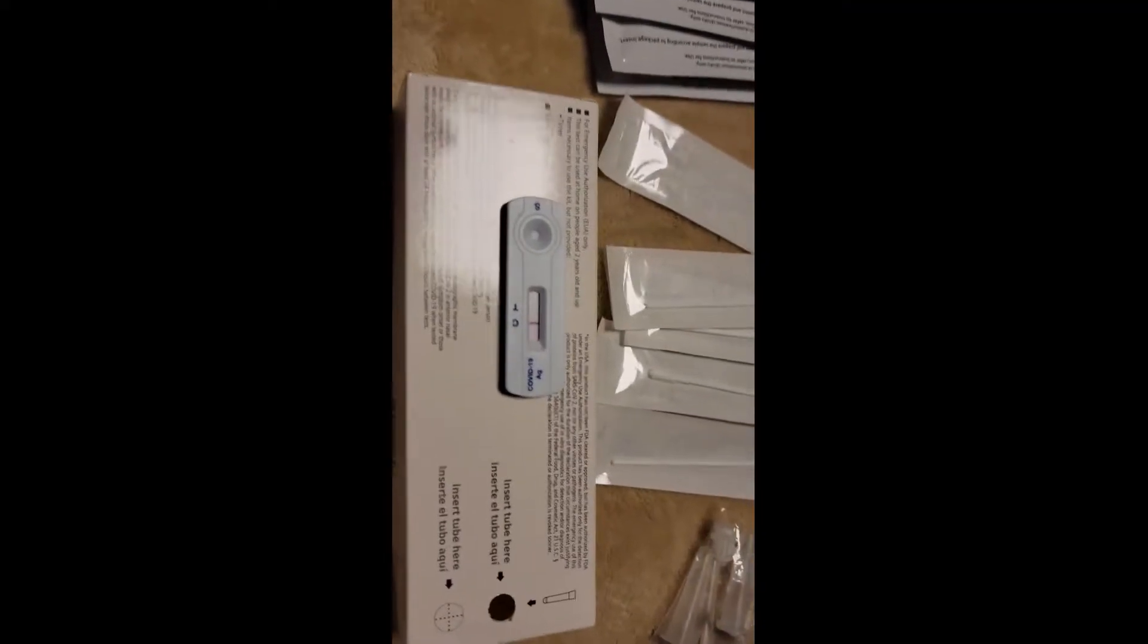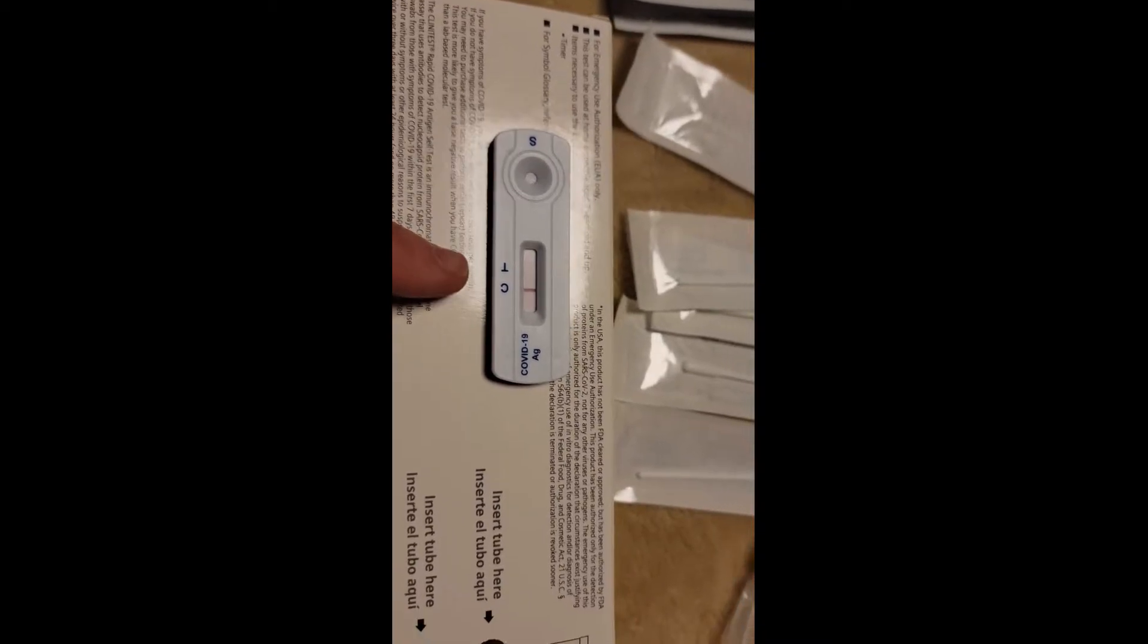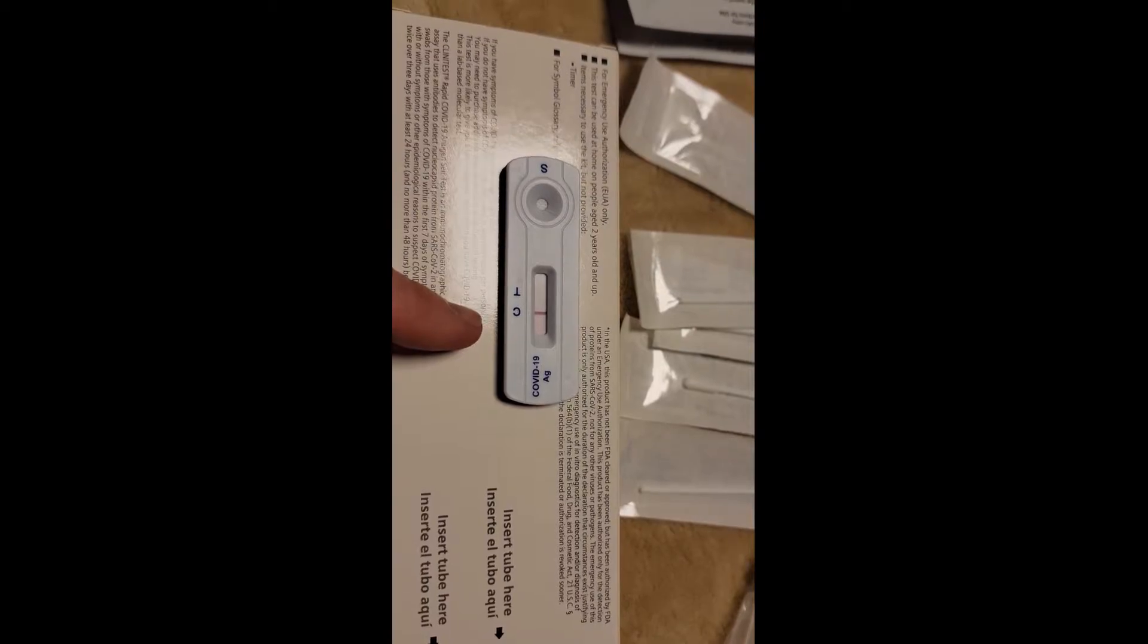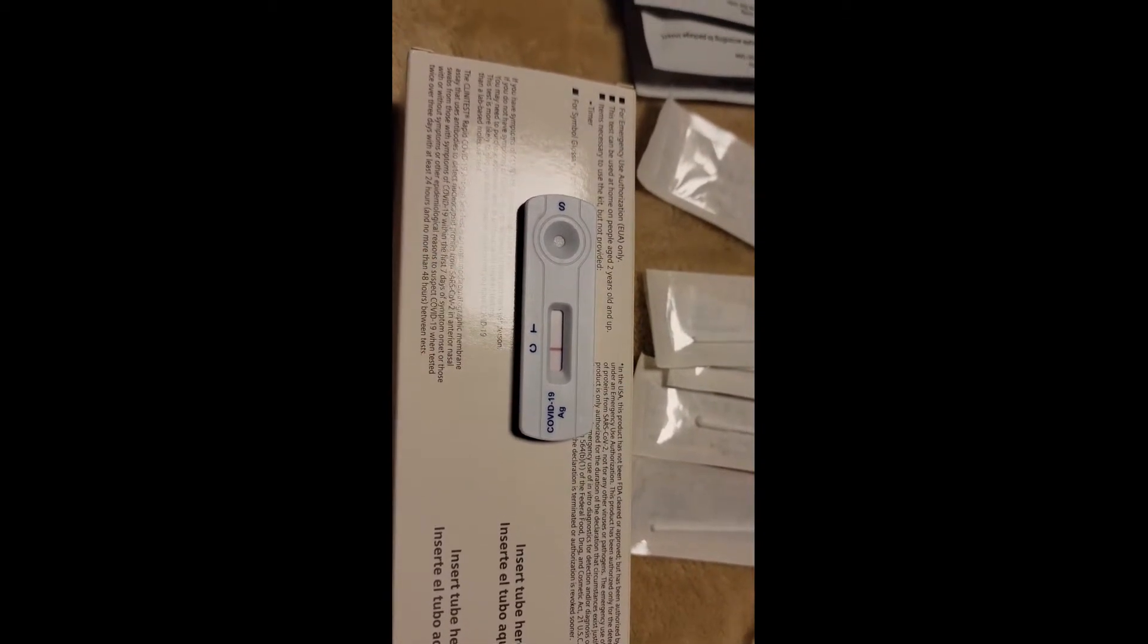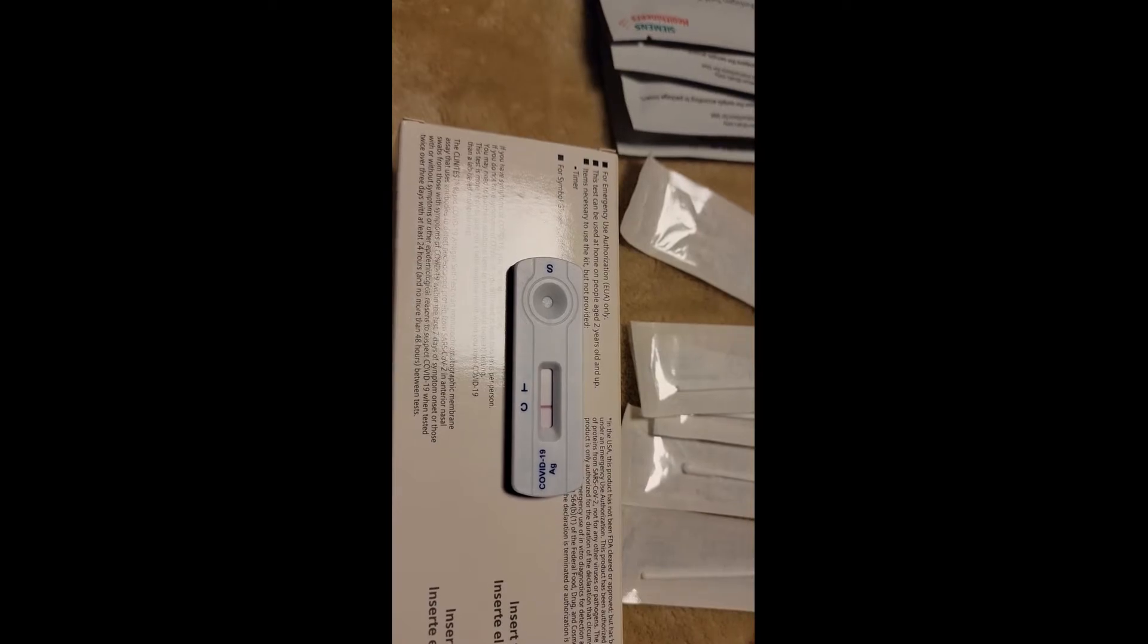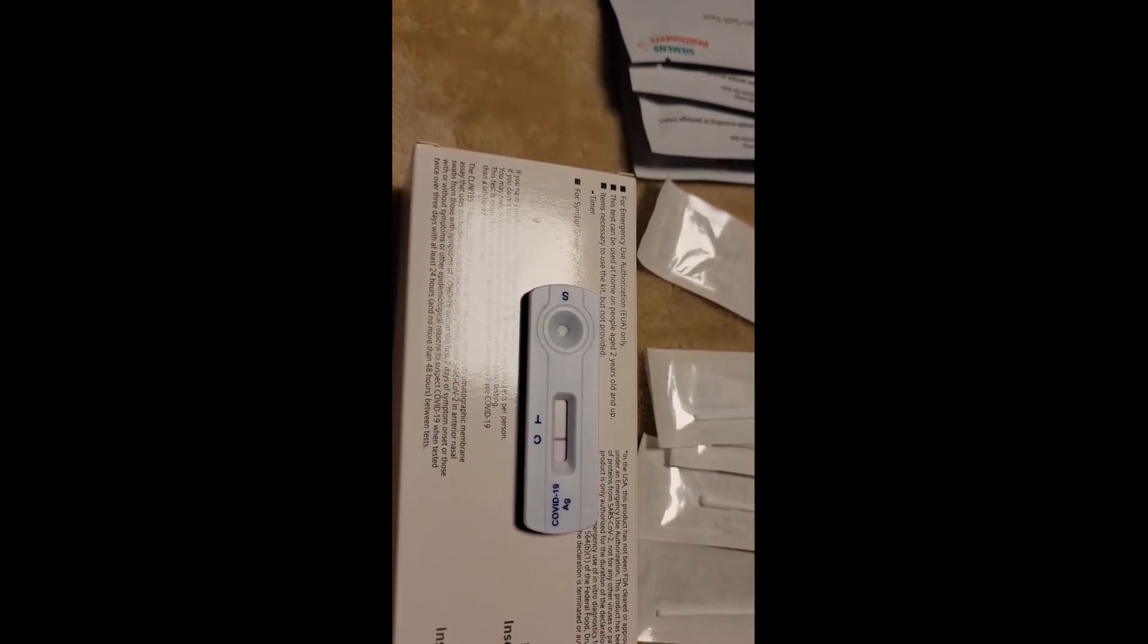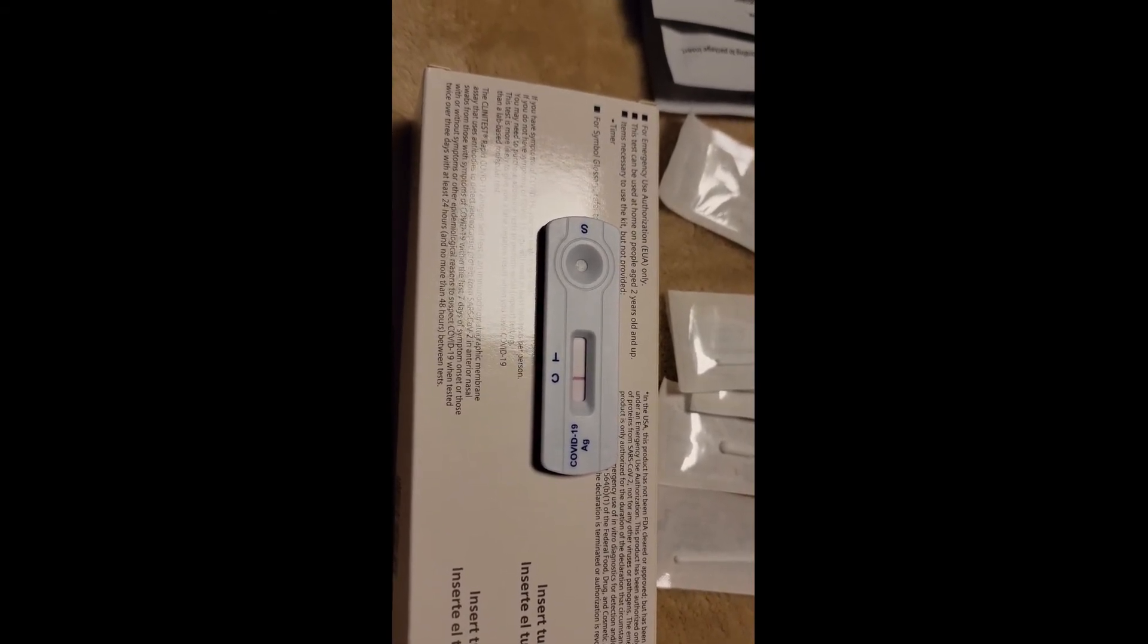Okay. So one thing I forgot is if it has the T in there, then it's obviously positive. The C, if it's just a line on the C, it's negative. C and T is positive. And just T is an invalid reading. So there I thought I would clarify that. And I think we covered all the bases on this one. Make sure to follow the instructions. And have a good day.